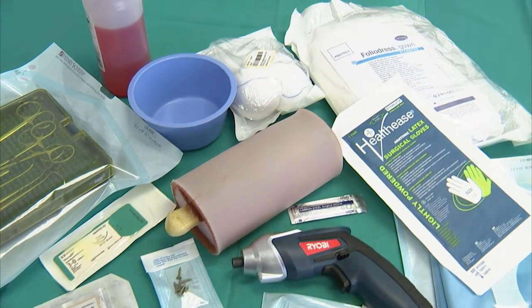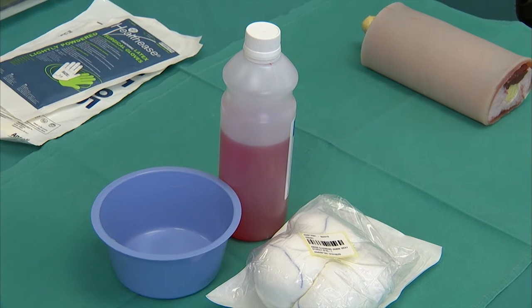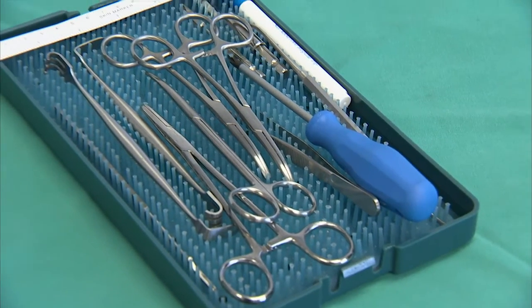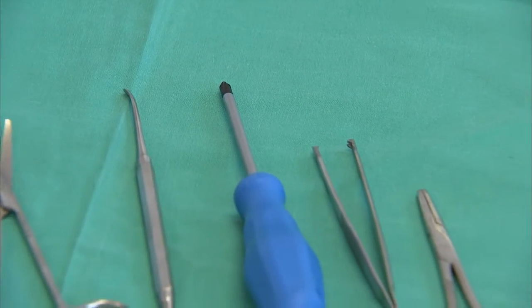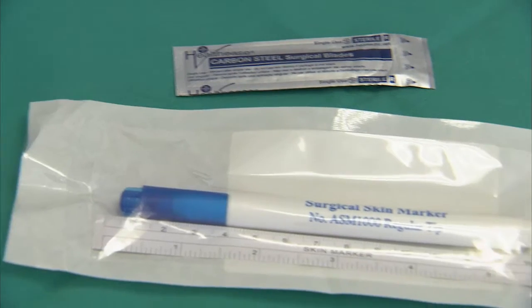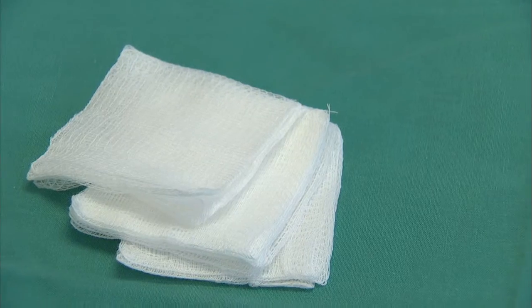You will need the following items: sterile gloves, a surgical mask, a clean work surface cover, an antiseptic solution and gauze for preoperative cleaning, a suitable drape to isolate the operative area, a set of surgical instruments containing 2 cat's paw retractors, 2 bone repositioning forceps, a pair of scissors, a periosteal elevator, a cross-slot screwdriver, a tissue forceps and a needle holder, a marker pen and ruler, the surgical drill unit with accessories, a bone plate and bone screws, a scalpel with blades, sachets and the appropriate suture materials, gauze squares.